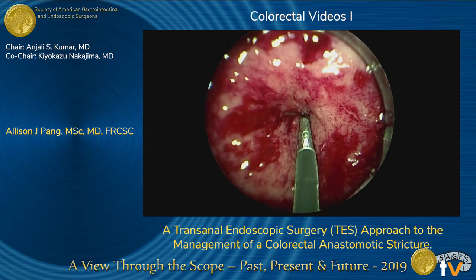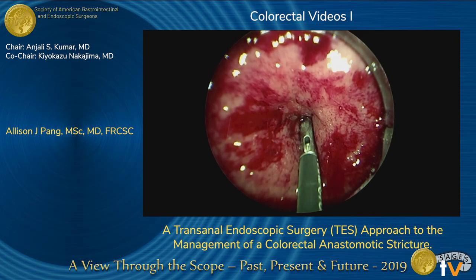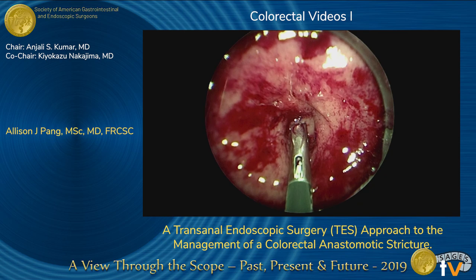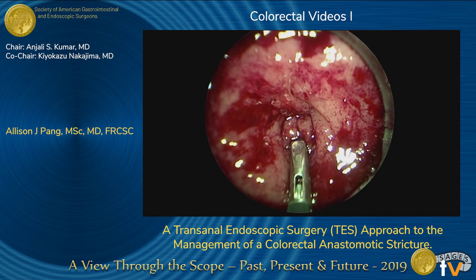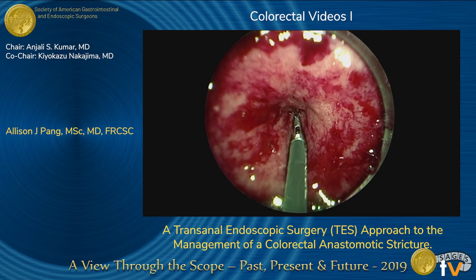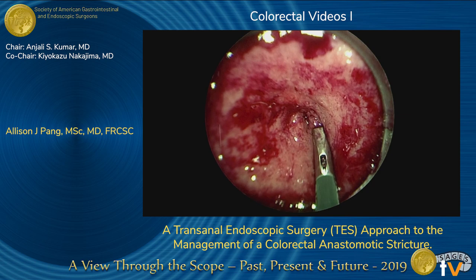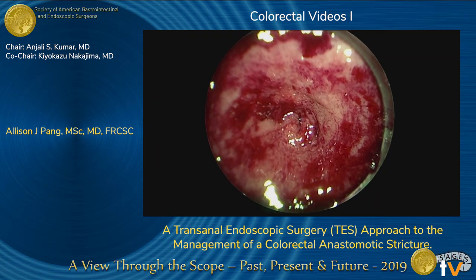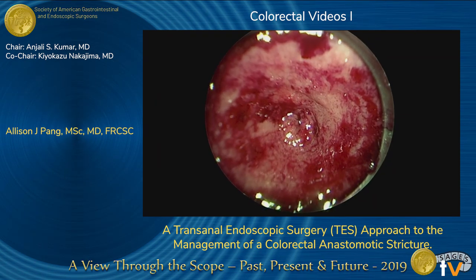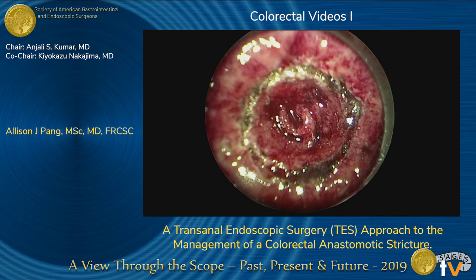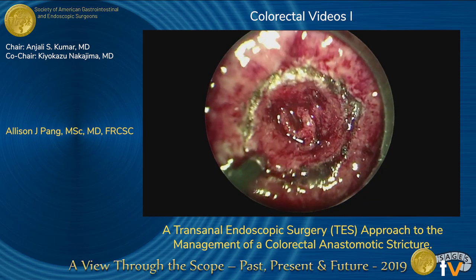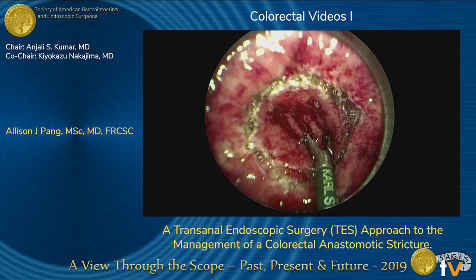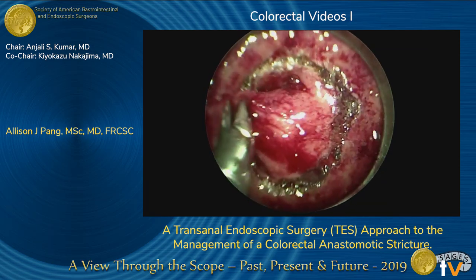We first set up the TEO platform using the long operating proctoscope. Here, where the instrument is pointing, is the stricture — you can tell it's very tight and it's at the level of the anastomosis. To begin, we used electrocautery to mark out our circumferential resection margin, making sure we had a good margin, which we did.